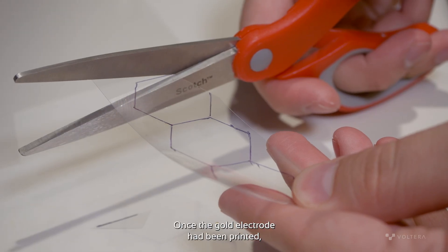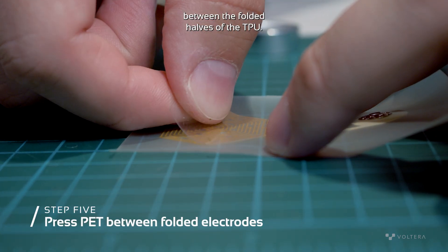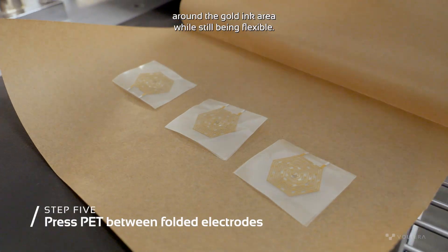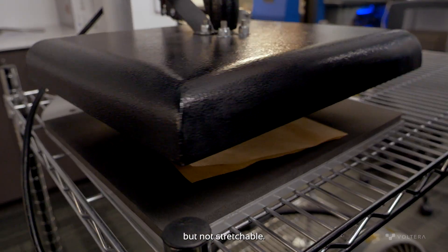Once the gold electrode has been printed, a T-shirt press is used to sandwich a piece of PET between the folded halves of the TPU. This reinforces the print so that it has functionally zero stretch around the gold ink area while still being flexible. This is important because, as mentioned previously, this gold ink is flexible but not stretchable.